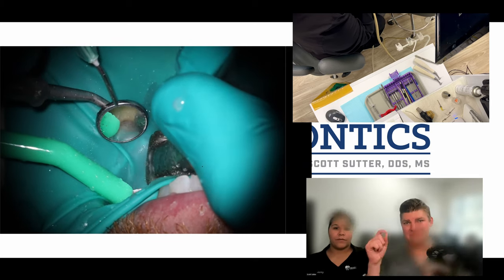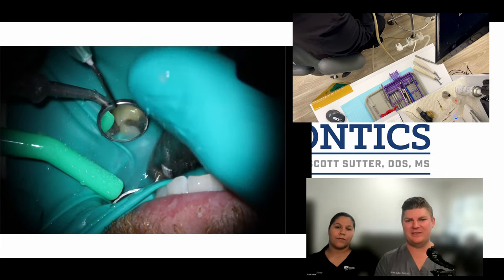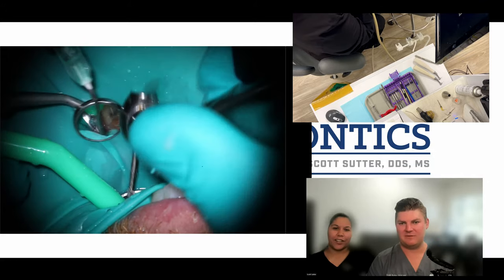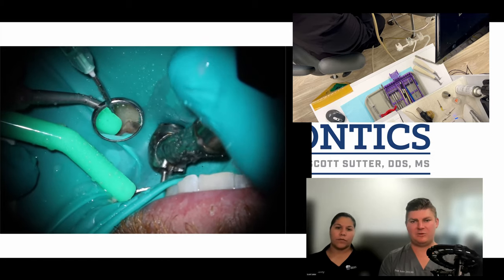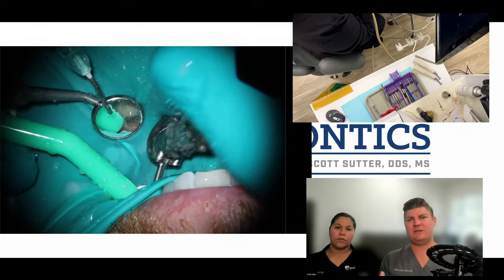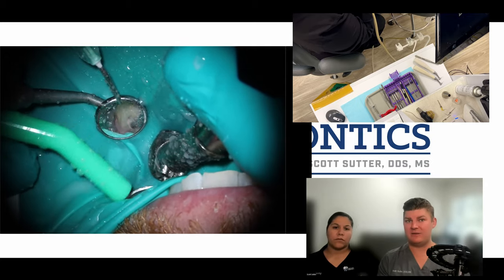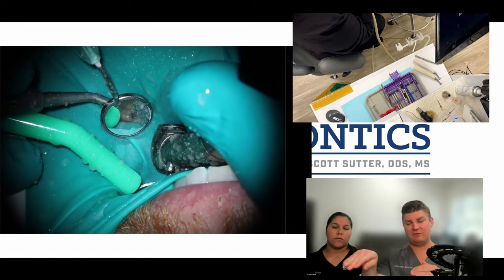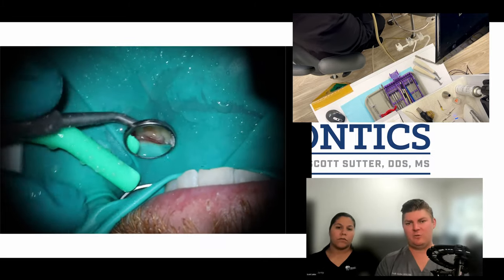What you see in the microscope is recorded with one of the cameras attached to the scope, and this is just my iPhone for the back side. I had to kill all that audio because we had music going and I don't need to deal with royalties. You saw we knocked that little piece of composite out of there and now we're going to be cleaning out the caries, which exposes the pulp. The most important thing for the assistant right now is just to keep that mirror nice and dry. From an efficiency standpoint, if I have to keep wiping the mirror, that's where you really lose a lot of speed.